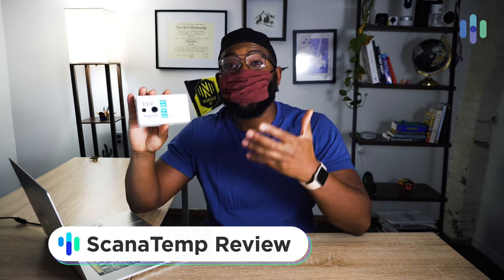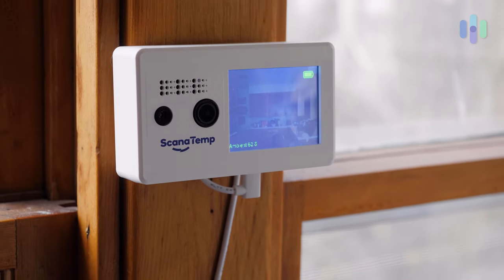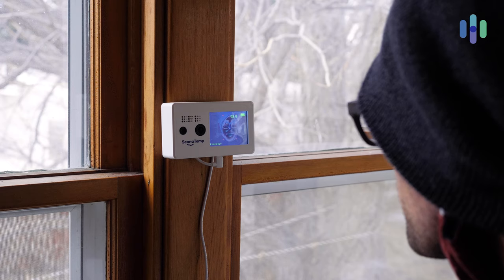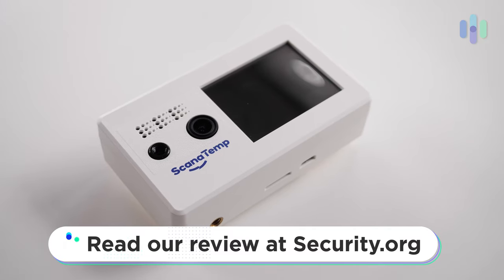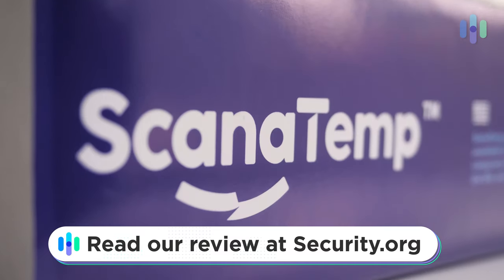Hey folks, this is Gabe at security.org. Today we're checking out the Scan-a-Temp Rapid Temperature Scanner and Mask Recognition Device. This is a pretty intriguing device. Maybe you own a business or have an organization where you need to know who's coming in with a higher temperature and who is or isn't wearing a mask. We're going to give you a detailed review of Scan-a-Temp in terms of its functionality, installation, and things of that nature. You can get a detailed review over at security.org. Let's go ahead and dive in.